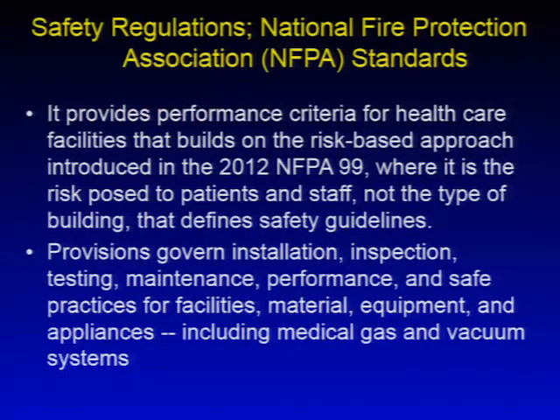Now, in the United States the government has safety regulation through the National Fire Protection Association standard. In 2012, NFPA 99 has a regulation of OR safety. That provision governs installation, inspection, testing, maintenance, performance, and the safety practice of all equipment you can use in the OR room or the hospital.